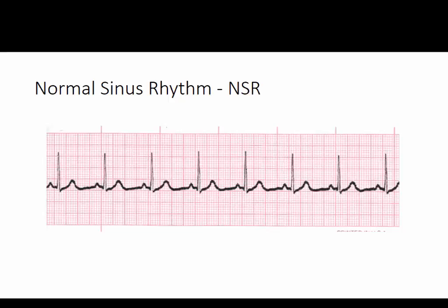I'm like, I don't know which one this is, because it doesn't have any of the parts that are abnormal, right? And talk about getting lost in the trees and not seeing the forest. That was a perfect example. Then finally, duh, it hit me. Well, that's because it's normal sinus rhythm. But I was freaking out for 5 minutes over this, looking for the abnormality. So don't let that happen to you, because one of the options is a normal heart rate.